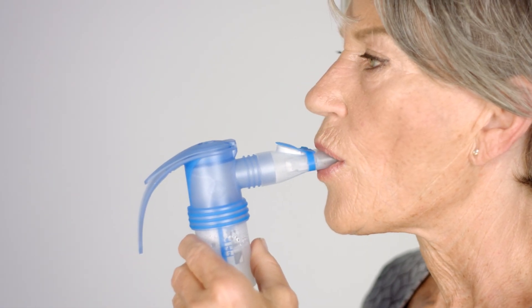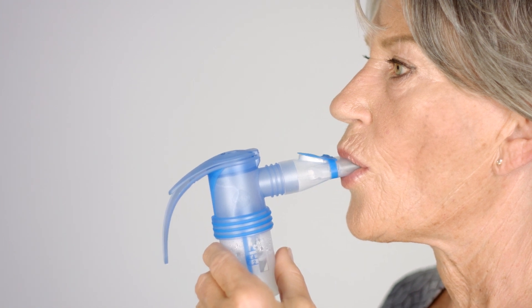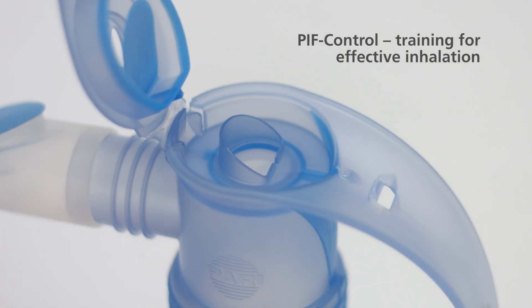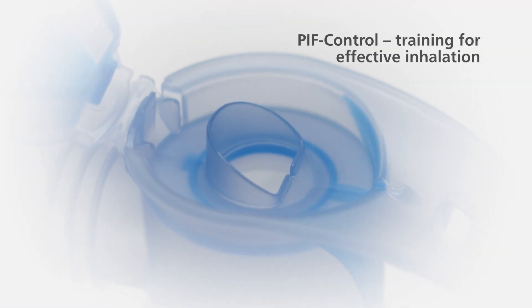Clasp the mouthpiece between your teeth and close your lips around it. Breathe in slowly and deeply. If you inhale too quickly, the PIF control system generates resistance and emits a brief soft sound. As soon as you notice this, briefly stop inhaling and then inhale slowly again.